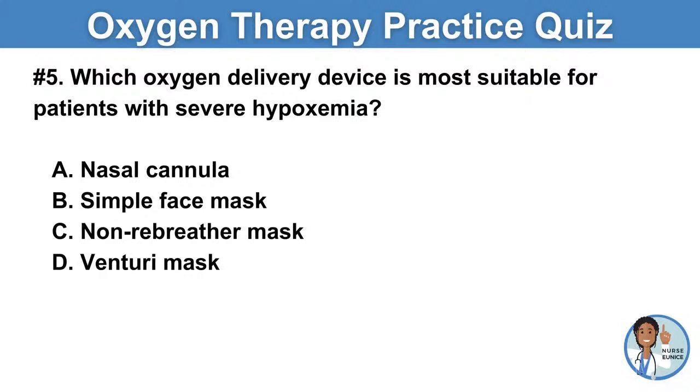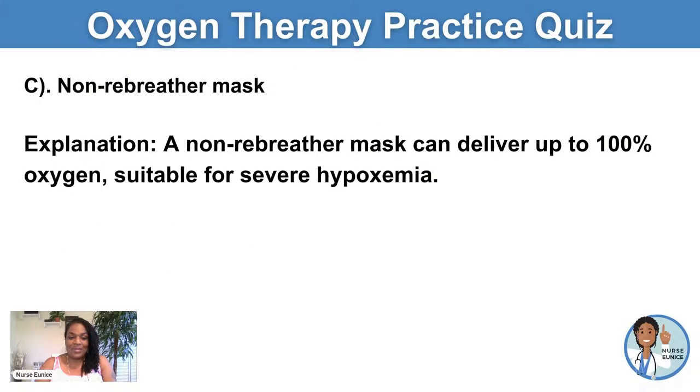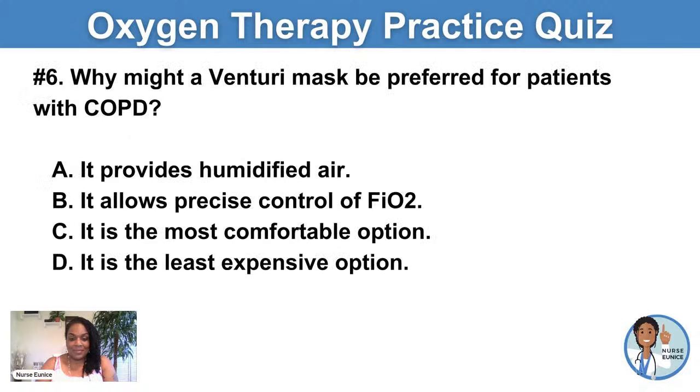I think I see some correct answers. Yes, Katie Ann. Yes, Diamond. Yes, Shamika. Yes, Karen. That would be the non-rebreather mask because it can deliver up to 100% and it is suitable for those who have severe hypoxemia.